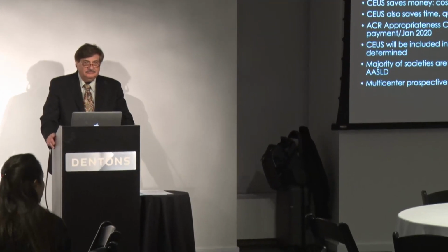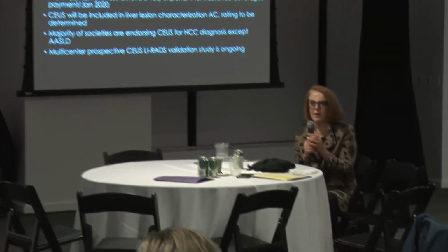But having said that, the quality of what we do is so important. And so, for example, I'm just astonished when people get up and talk about how terrible surveillance ultrasound can be. And so you have to really run roughshod over the places in your geographic domain that say that they offer surveillance ultrasound, because you can't just go in and take an 8-minute scan and whip across the liver with one probe and then say there's nothing there. You have to really, really look. And a lot of people just aren't interested.